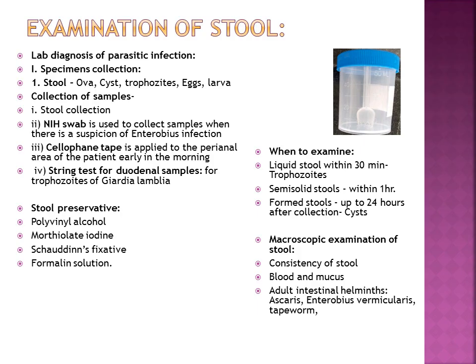Then after that, stool preservation can be done in polyvinyl alcohol, merthiolate iodine formalin, Schaudinn's fixative, or formalin solution. So this is a stool container: a plastic, sterile container with a spoon attached to the lid of the container.